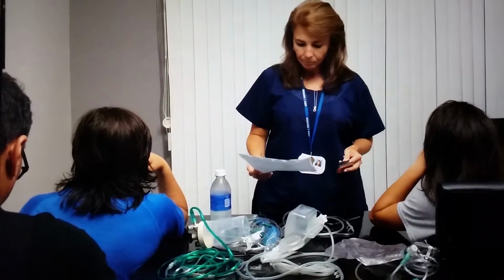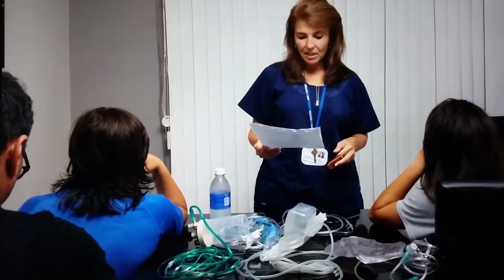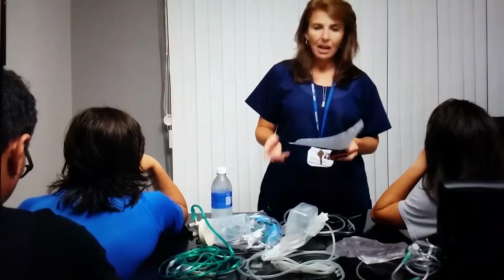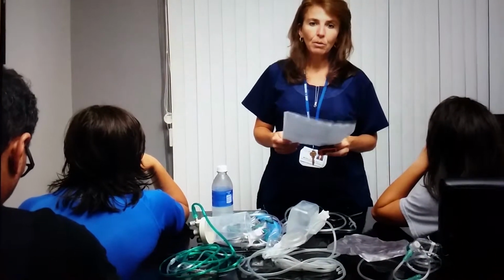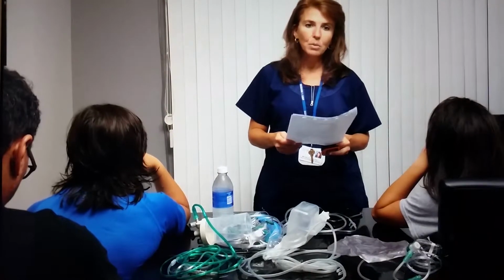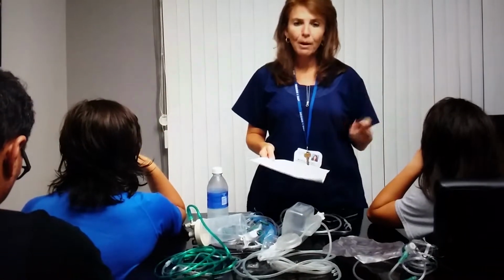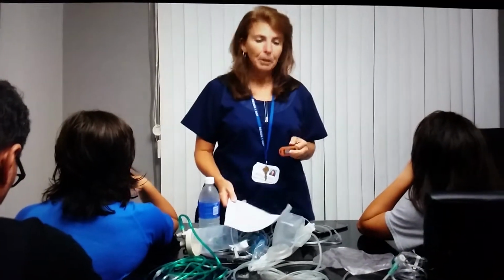Pulse oximetry is indicated for monitoring of oxygenation and can provide early warning signs for hypoxemia. I'll be citing an abstract from Drew Braun in a Critical Care magazine from 2015, as well as the hospital-wide and respiratory care policies and procedures for this presentation. Correct application of pulse oximetry is very important.